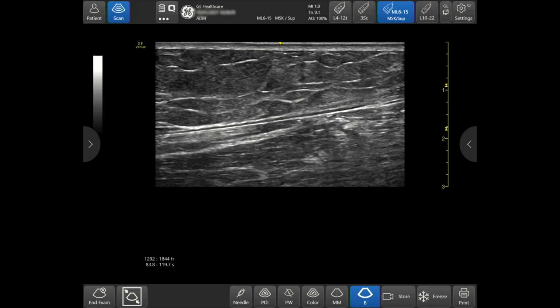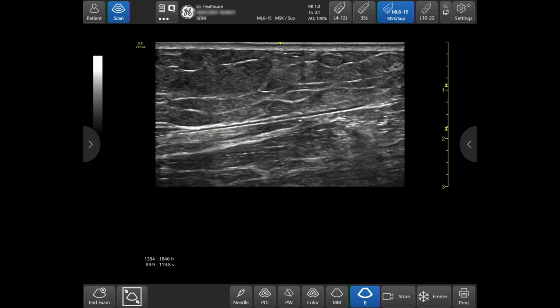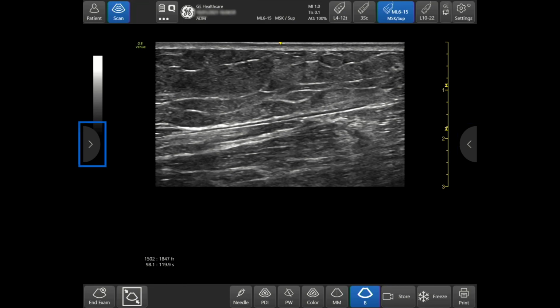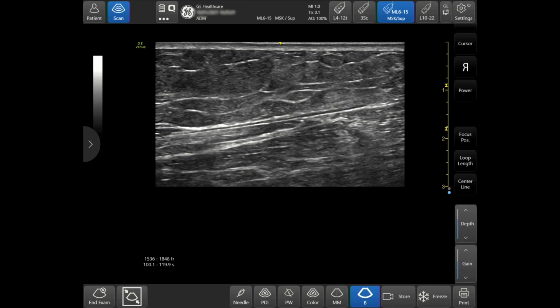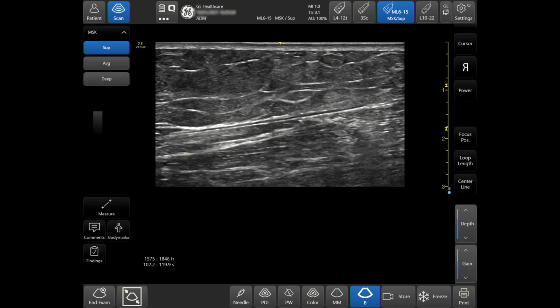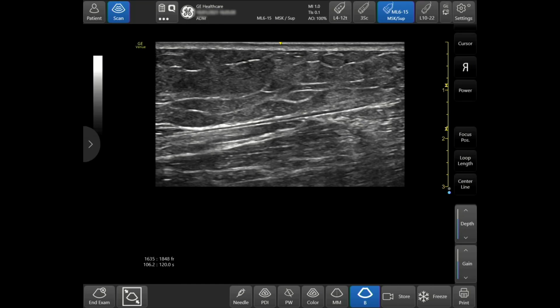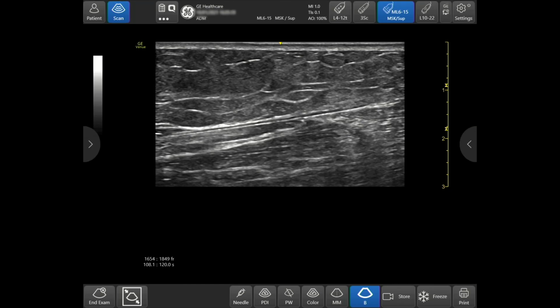The default scan screen layout, simple or advanced, is configurable. The modes and side menu options available while using Simple Screen are also configurable. When in Simple Screen, simply tap or swipe the arrows to display the side parameter icons. Don't worry, they'll time out and disappear when you're done. You can set the preference for the timeout period in the Configure menu.